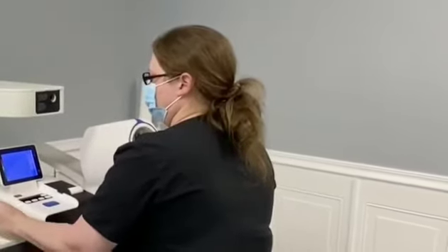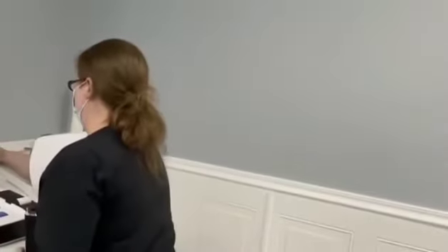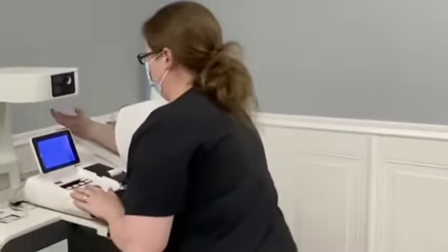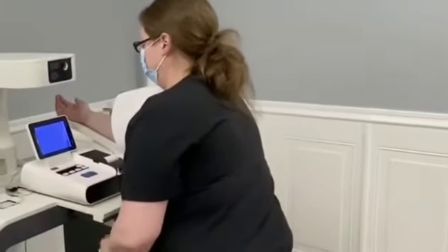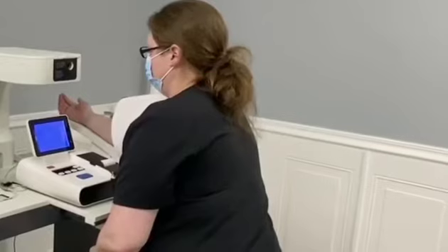Start measuring blood pressure. Put your arm in the cup and press the start button. Hand up. Please keep quiet.